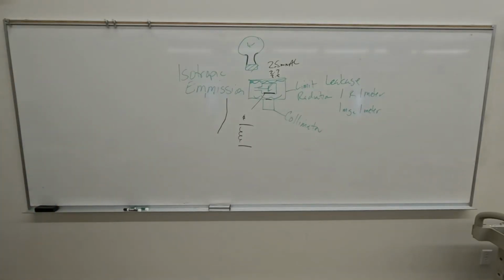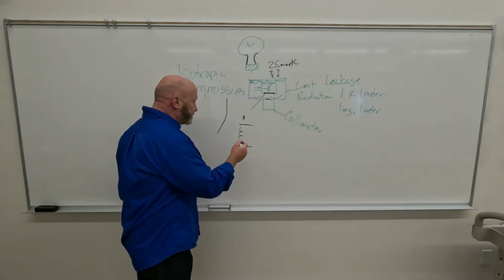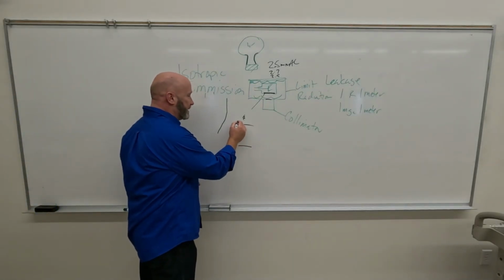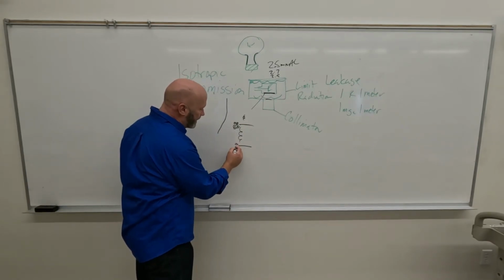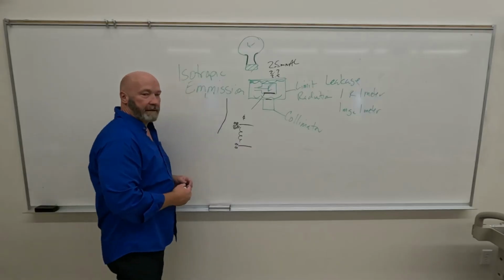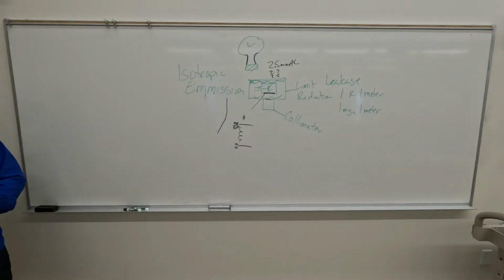What was the blooming again? Blooming is where you have that high mA and your electron cloud, your thermionic emission, is so big that it kind of escapes the focusing cup. So you're trying to make a connection between the two, and there is a connection there.